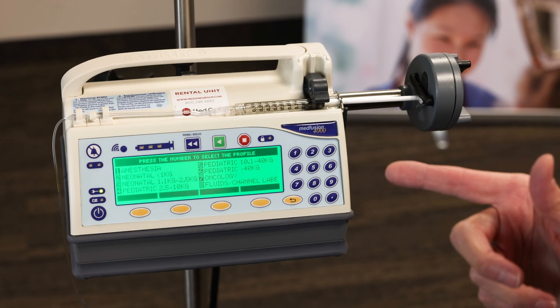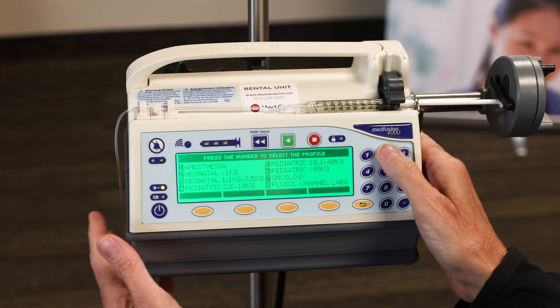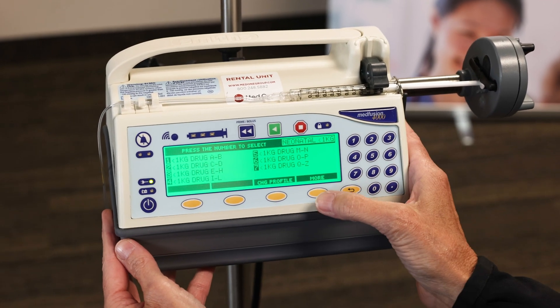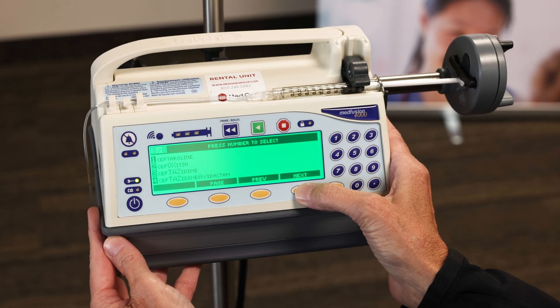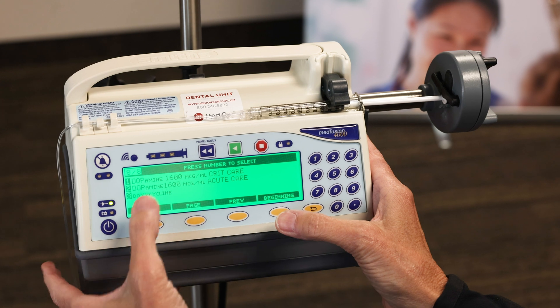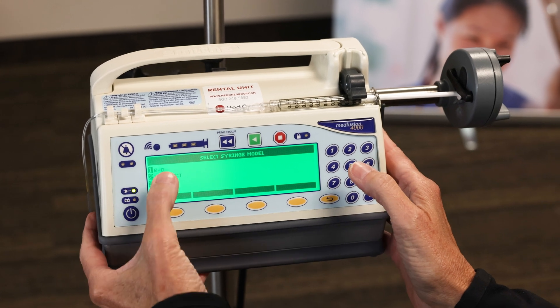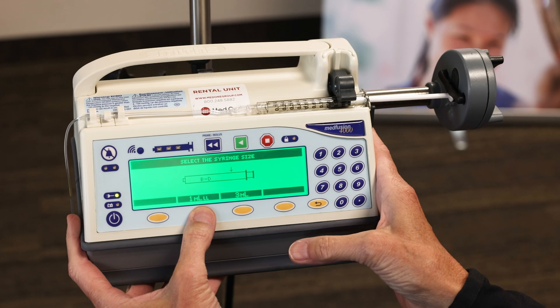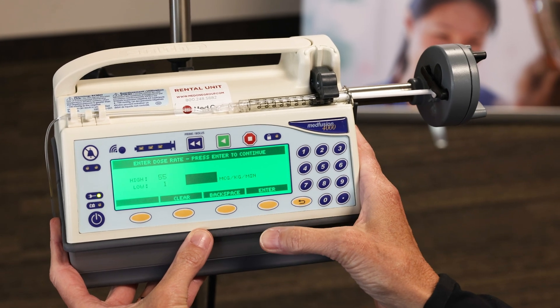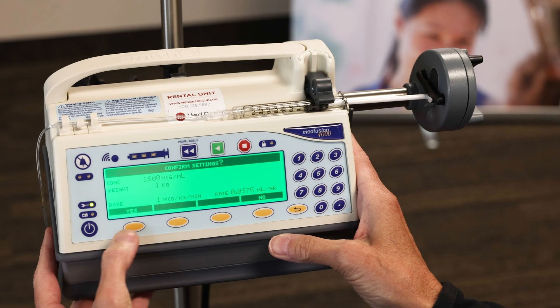I already have my next syringe loaded for our continuous infusion. We're going to be using dopamine with a 1 ml syringe. Go back into the same profile — number 2 for one-or-less kilos — then choose number 2 for drug, C through D for dopamine. Press next to toggle to the Ds; you'll see tall-man lettering for those sound-alike and look-alike drugs. I'll use the first one, the critical care dopamine, and say yes, that's what I want. Confirm the syringe is BD, size 1. The patient weighs 1 kilo — press enter. Start with a dose of 1 — press enter. Confirm the settings, yes.